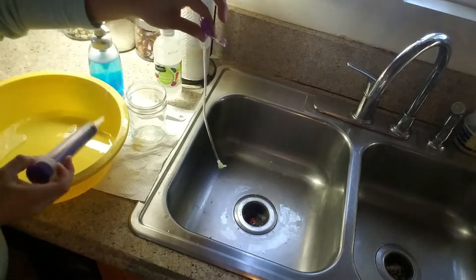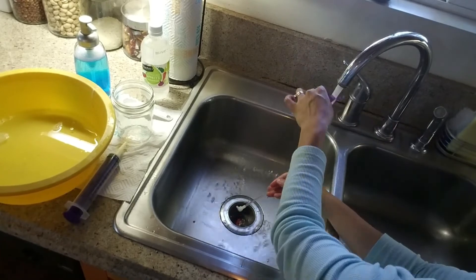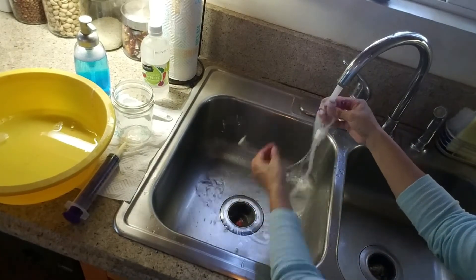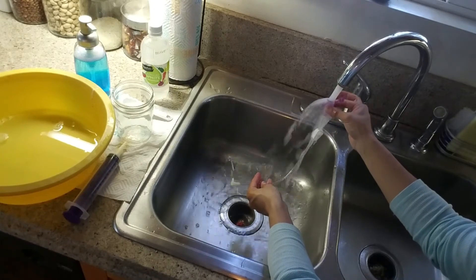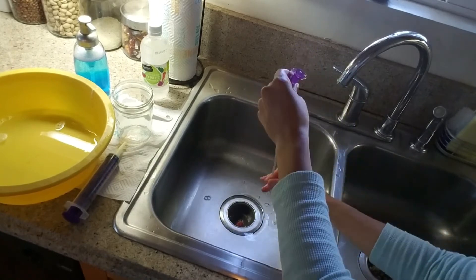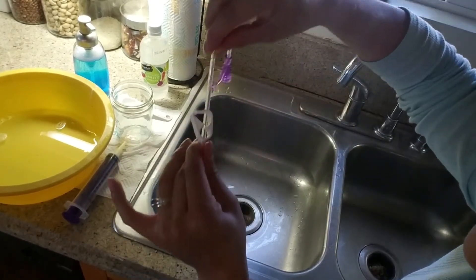Then you just rinse both ports and the entire extension out with running water. So there you have it — just a quick and easy way to keep your extensions clean throughout your weekly feeds. I hope you enjoyed the video, and I hope to bring you some more little tips and tricks I've learned along the way when dealing with a G-tube.